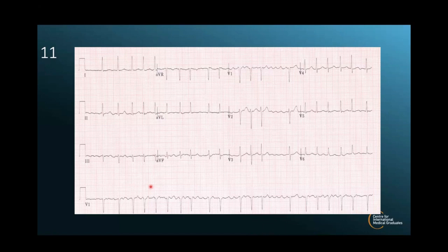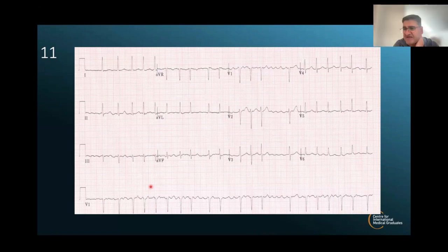Okay? And remember, it fits in, right? We've got a lady who is elderly, who's got urinary symptoms, inflammatory markers that are up. She's confused. So it's probably atrial fibrillation, fast ventricular response in the context of a urinary sepsis. Yeah, very, very common sort of clinical scenario.